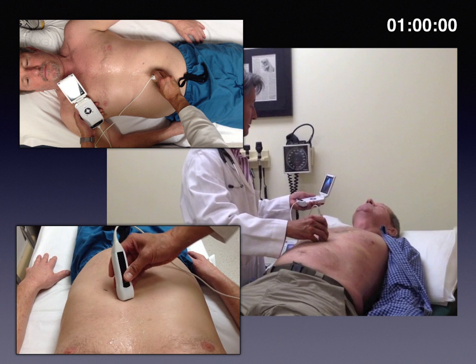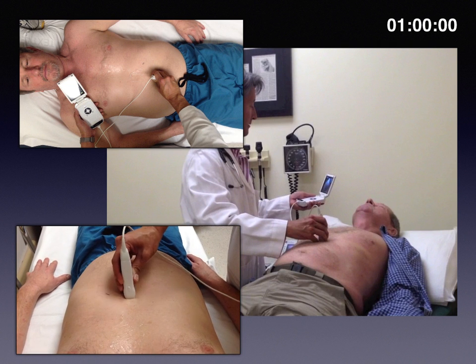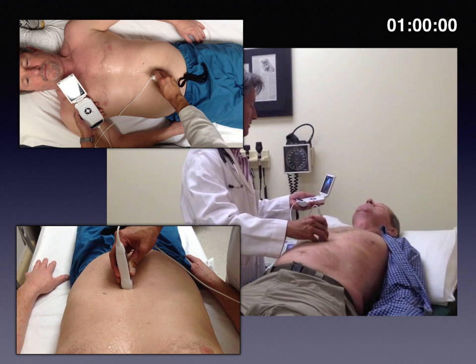Now, we also use this midline view and trace down to the aorta to rule out AAA, since we must differentiate the IVC from the aorta in this view anyway.